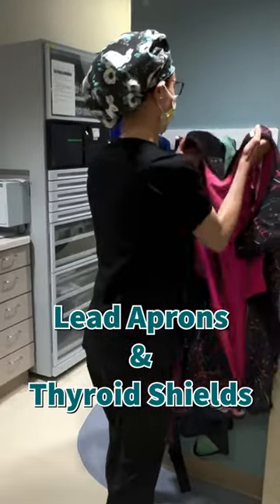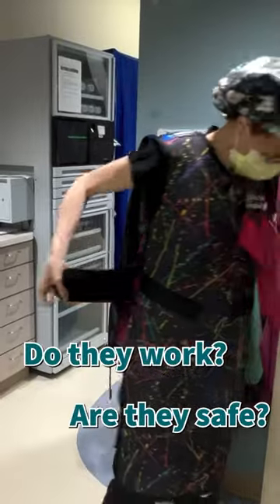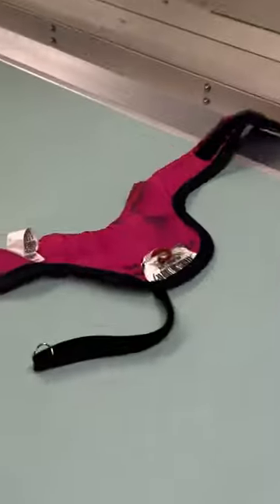Radiologists wear special lead clothing to protect ourselves from x-rays. But how do we know that it's actually blocking the x-rays properly? We do routine inspections by shooting x-rays at our clothing, and it's actually quite fun to look at.